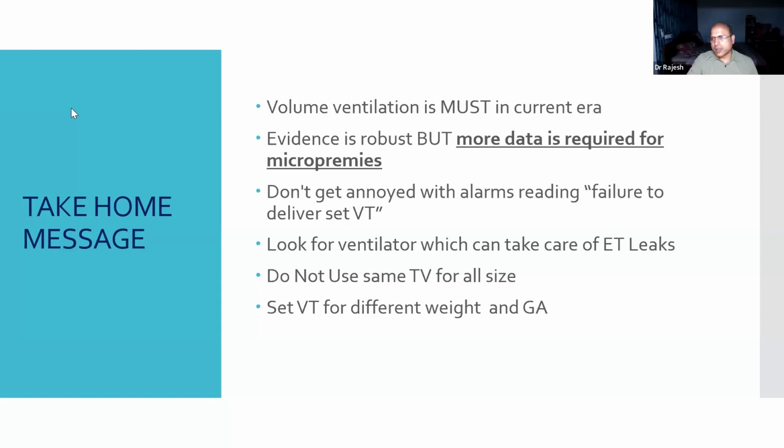And what volume do you target, lower or higher? We try to start with 4 to 5 ml, Rajesh. Four and five, there's a lot of difference. 4 and 5, okay, 4.5. For the unit, that depends on the consultant in my unit. But if I am there, 4 ml per kg.